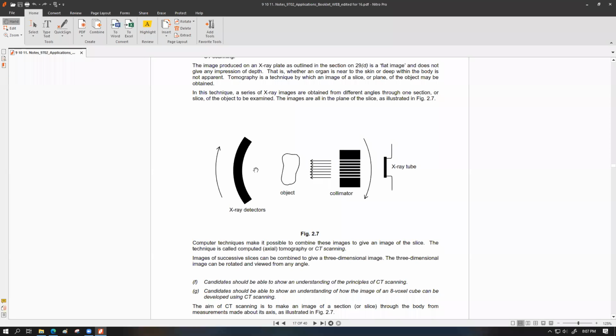Then we're only going to have a very weird CT scan, because that picture is not going to be worthy to diagnose anything. That's a very large voxel size, because a huge amount of mass has been broken into too few pieces.